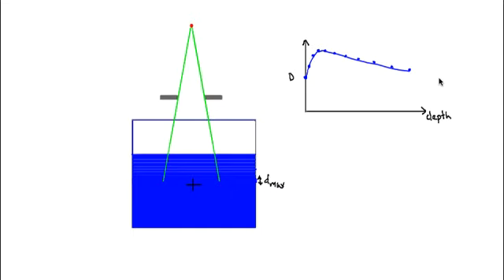Now, you'll see here that since the point of measurement is not moving, there's no inverse square effect, right? It's sitting at the isocenter point, and the only thing that's changing here is the attenuation. So we took out that inverse square effect.